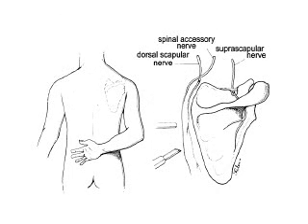There are three nerves about the scapula, namely the dorsal scapular nerve, the spinal accessory nerve, and the suprascapular nerve. These are important when placing portals. To avoid injuring the main branch of the dorsal scapular nerve, both portals are placed inferior to the spine of the scapula.